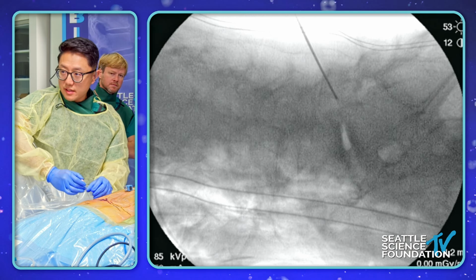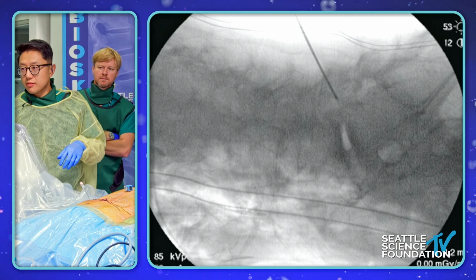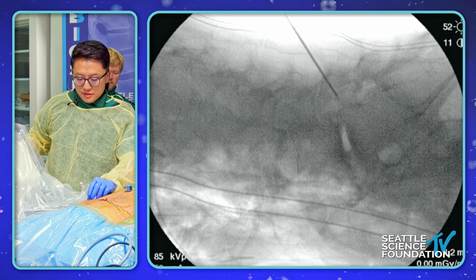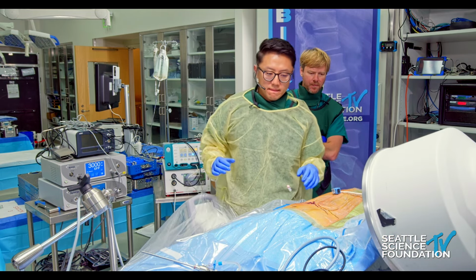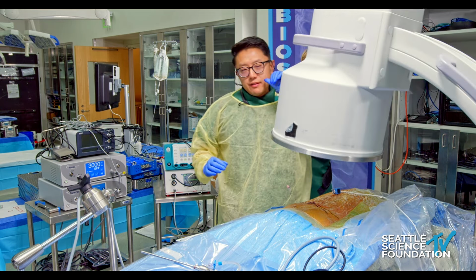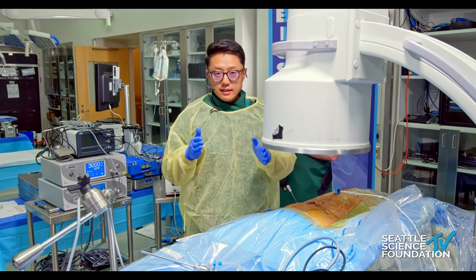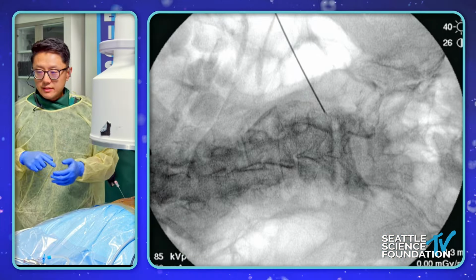But you're right. This is not a huge foramen, but it's not a super small foramen either, even though there's a slip, and so you could do a regular access as well. Why don't we get an AP and just see where we're at there? But I think the benefit of the trans-SAP is you have a rigid instrument, there's not a lot of bend to it like the needle, and so if you are targeting that ventral SAP, you'll get exactly where you want.